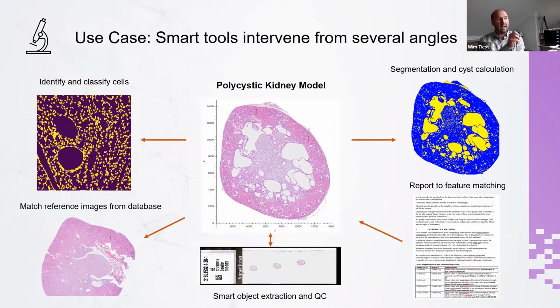So actually here the algorithm has tried to pick as clean as possible the individual cells and nuclei, which allows you to either assess their presence, but more importantly, to do quantification, to count them, to look at the size, to compare areas with, for instance, a large nuclei versus normal nuclei. So all these options actually are facilitated by the algorithm that does the hard work of selecting and separating the nuclei.